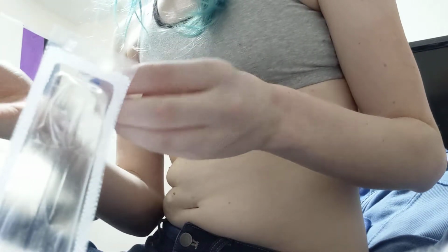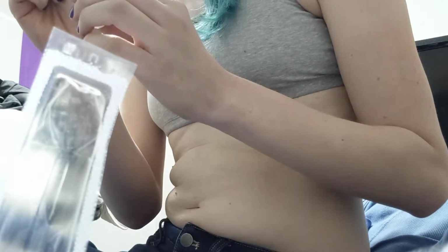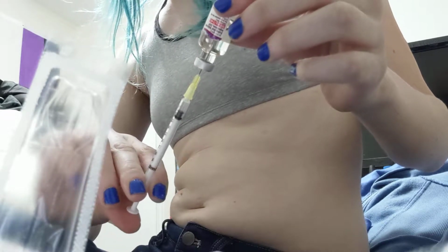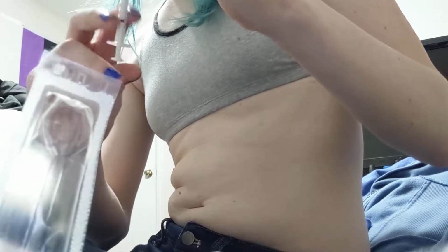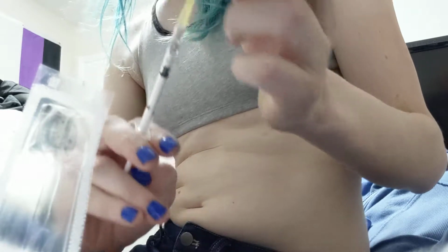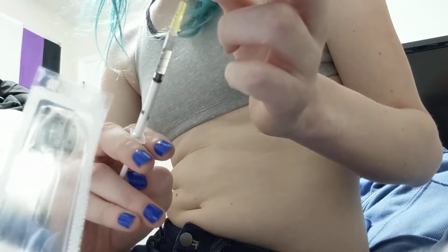I inject 0.3 milliliters, so I'm going to pull that down to 0.3 here. Stick that into the vial. Inject that air there to replace the fluid we're taking out. Then we're going to pull it back a little bit past 0.3 milliliters so we get enough pressure for it to come out. I usually draw it to about 0.4 or so.